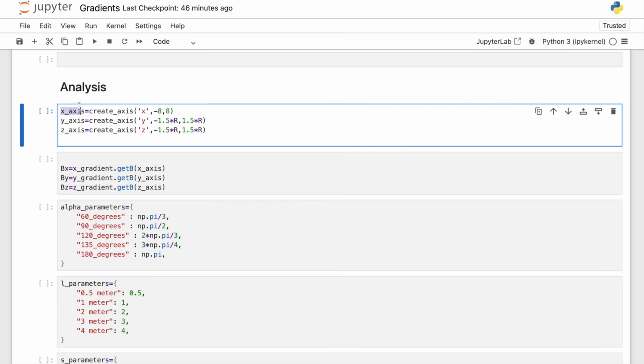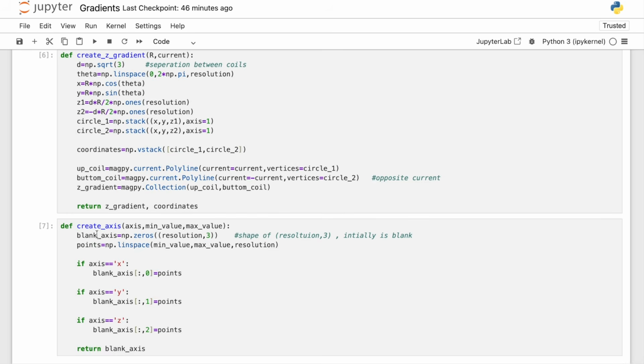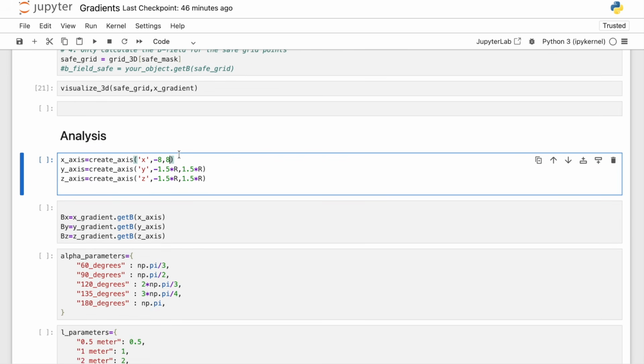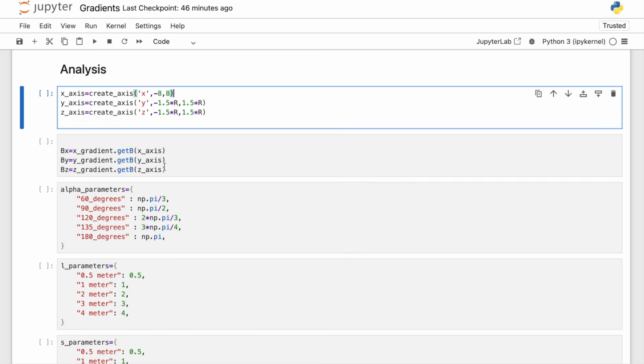So here I create my axes using the create axis function, which I defined here. So I create my axes of interest: x-axis, y-axis, and z-axis. So I input x with minimum and maximum values, y and z. These minimum and maximum values can be changed easily, but here I just hard coded them for ease of visualization, and we will just look at the x-axis, but it would be the same for y and z-axis as well.